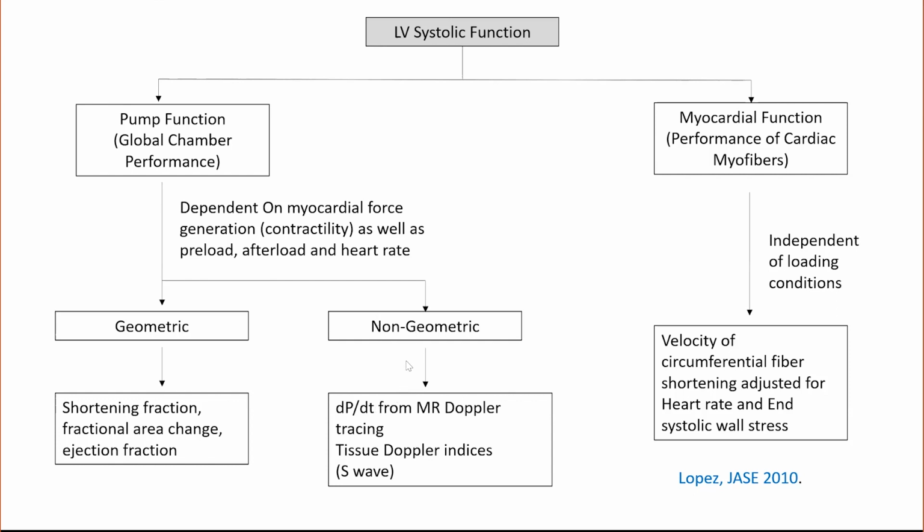Now, we're not going to talk about non-geometric functions as well as the myocardial, load-independent function in this talk. But if you're doing, say, critical care boards and stuff, then they're all fair game, and they will ask you questions on all of these. What we talk about is the geometric functions, and geometric, as the name suggests, involves some sort of measurement of the geometry. It can be linear measurements as well as area measurements or volume measurements. So shortening fraction, fractional area change, as well as ejection fraction fall under the geometric pump function measurements, and they are the most commonly utilized.